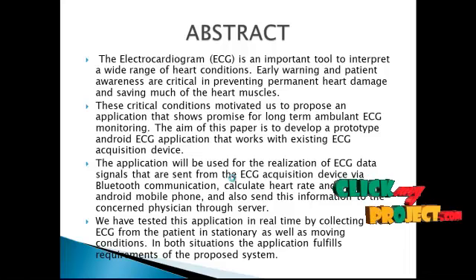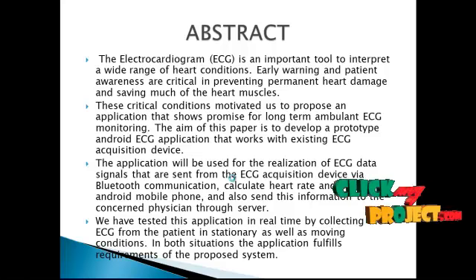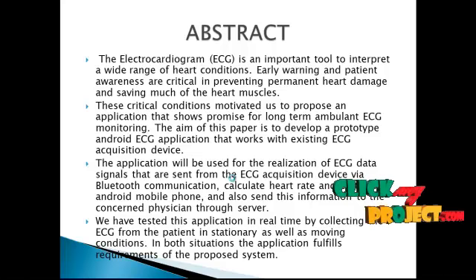First, the ECG signal grapher contains a way to measure and diagnose abnormal rhythms of the heart. The output of the ECG record is a graph or other software display with the voltage represented on the y-axis and the time represented on the x-axis.